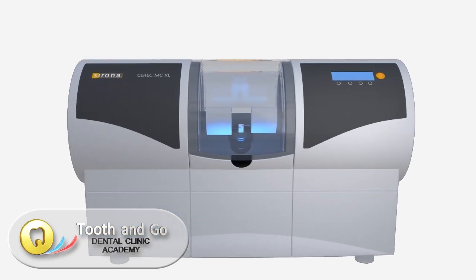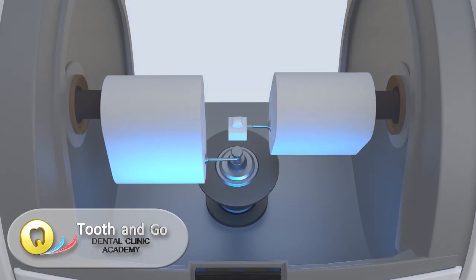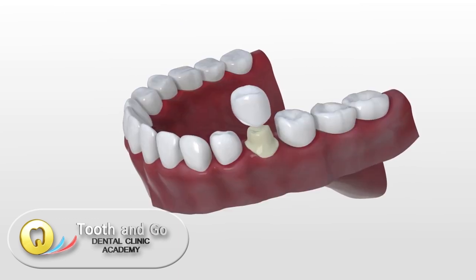The crown is milled with the most modern in-lab MCXL milling unit. The crown is filled with a self-curing composite and placed onto the prepared tooth.